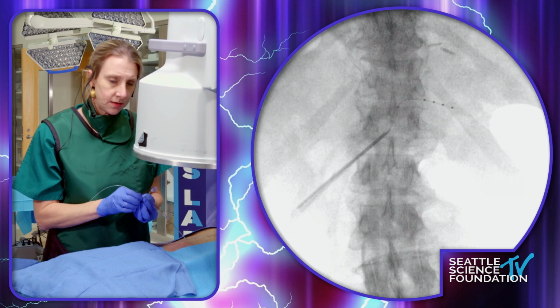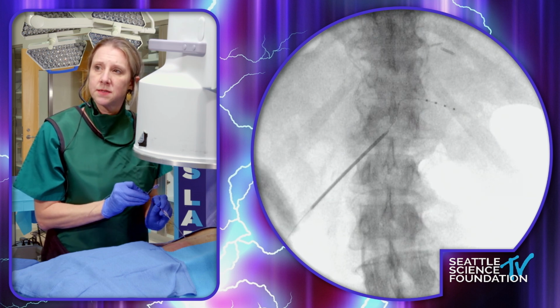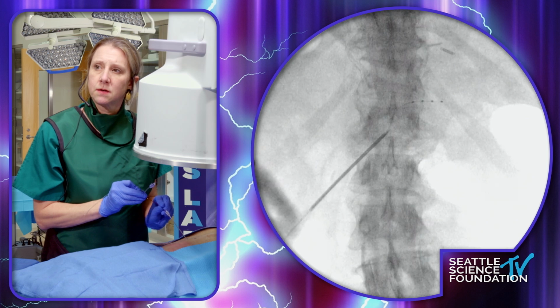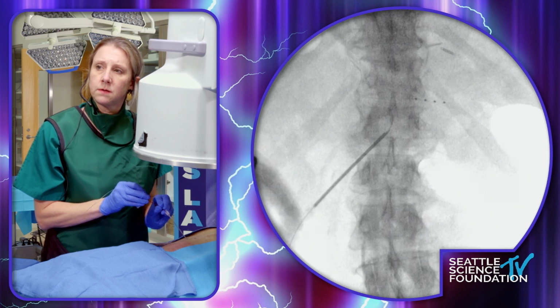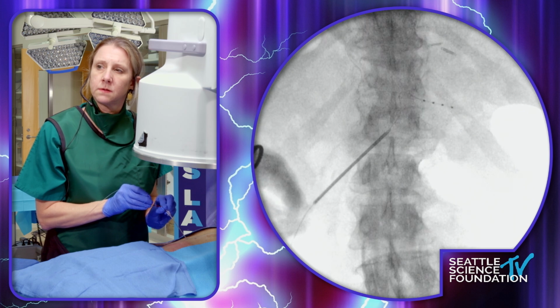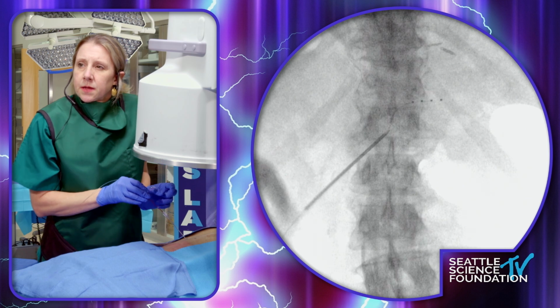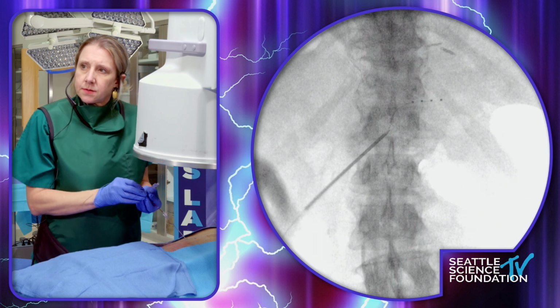Now I'm going to advance the catheter with the lead, and it still wants to just kind of go out. There it is. Stop. All right.